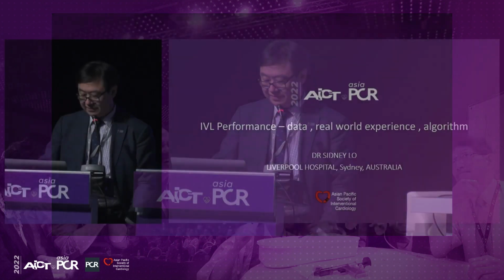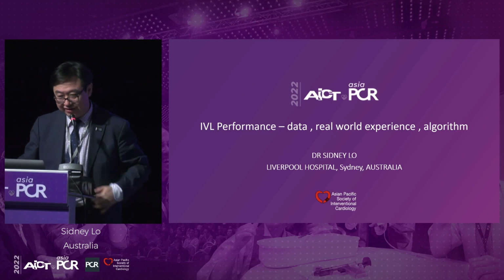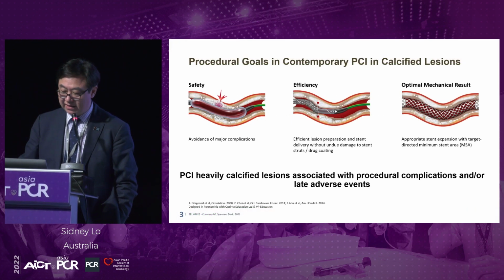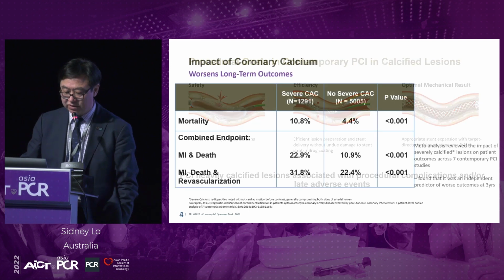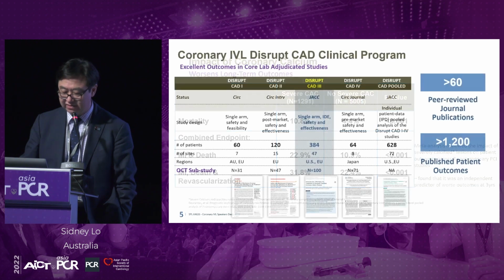Thank you. Deeper dive into performance across calcium morphologies and complex lesions, a real-world algorithm. So that was a great talk and a great segue to this part of the talk. We'll go through some of the data, and there are my disclosures. And we know that calcium is bad and is the enemy of the interventional cardiologist, for tracking, for complications and unexpanded stents, which lead to worsened outcomes. Severe calcification can lead to bad events such as mortality, myocardial infarction, and repeat revascularization.